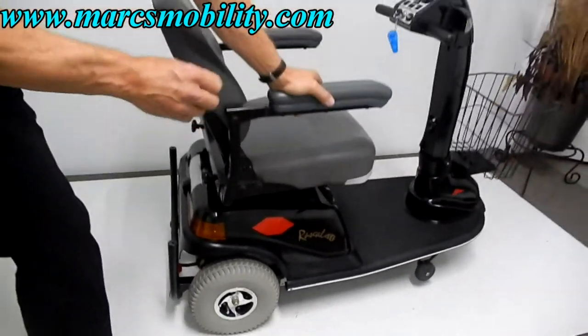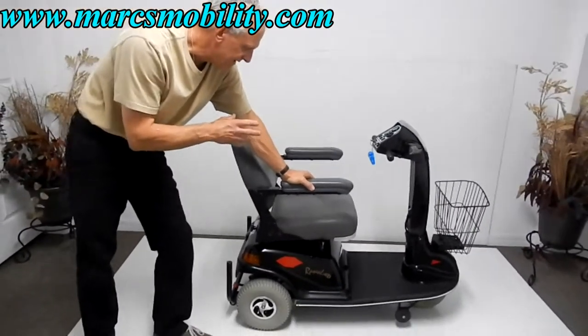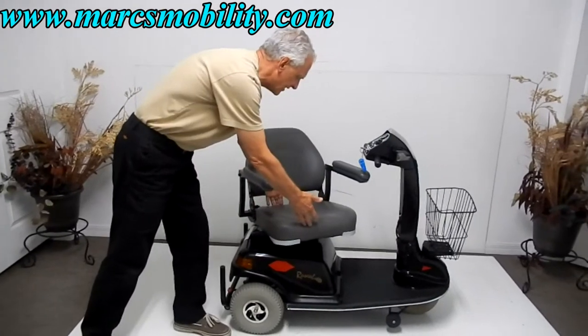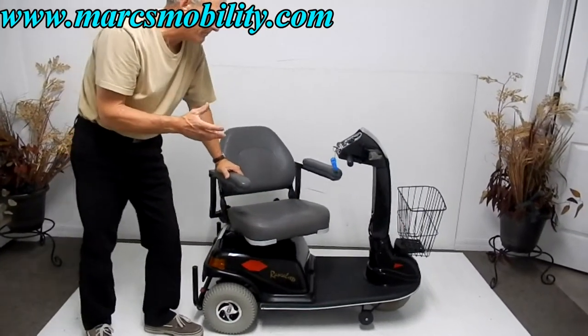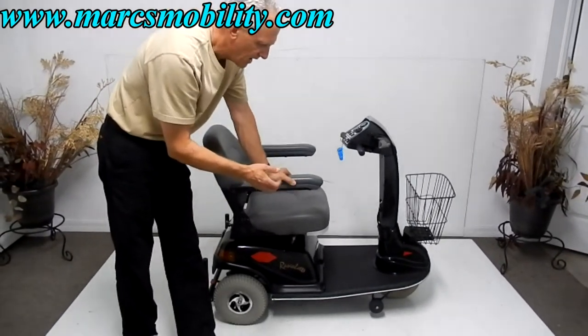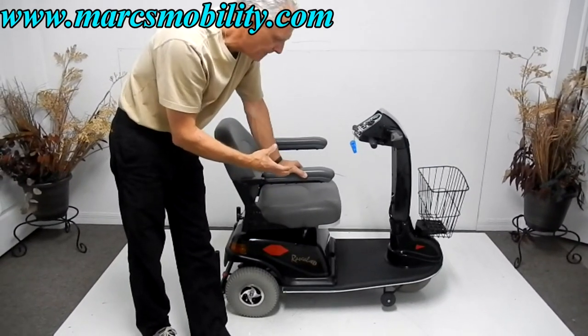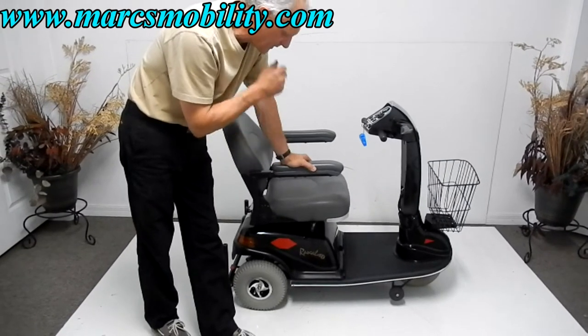This scooter has a 450-pound weight capability. The seat is not that large — about 18 by 17 or 16 inches — but the scooter will carry 450 pounds because the frame is well-supported, and the transaxle motor is very powerful.